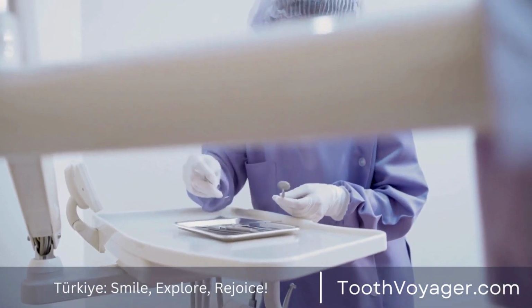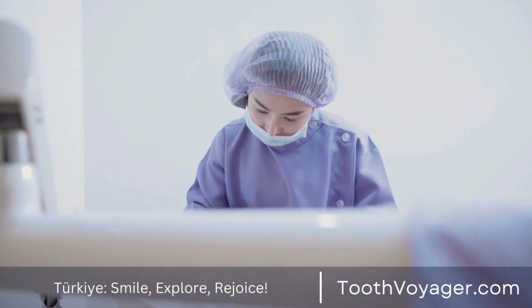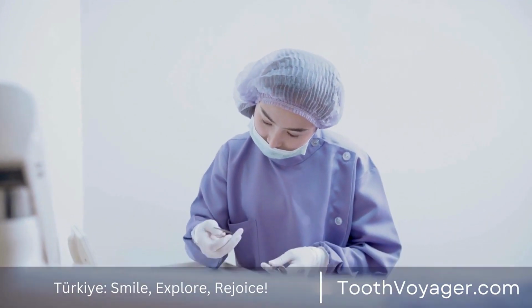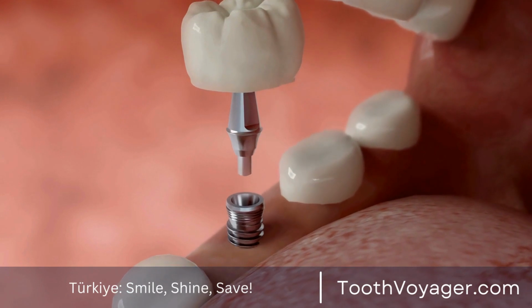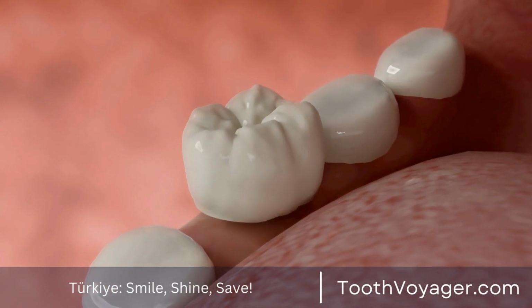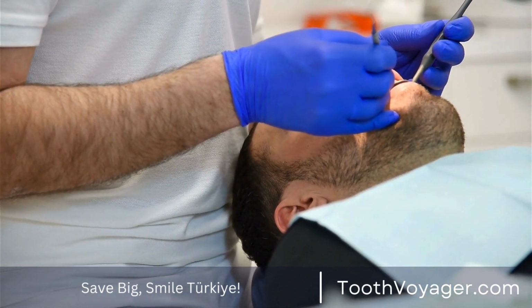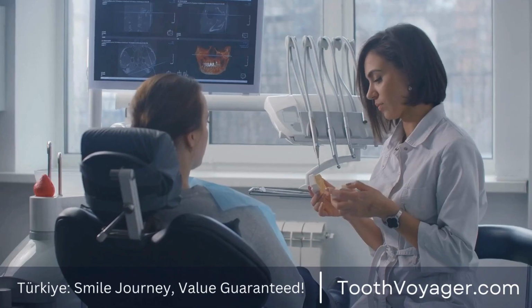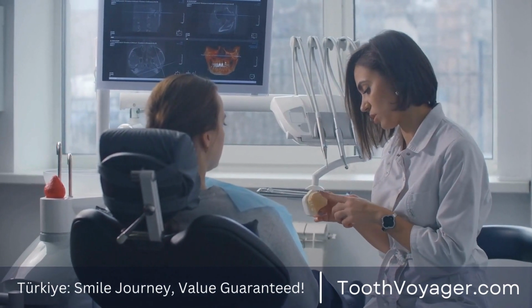Dental crowns, often referred to as dental caps, are prosthetics utilized to replace teeth that are damaged or degraded. The crowns are custom fit on top of the tooth in order to restore its form, size, strength, and appearance. The use of dental crowns is common to treat dental issues for a myriad of reasons. In this clip, we'll examine what dental crowns actually are and how they're utilized.